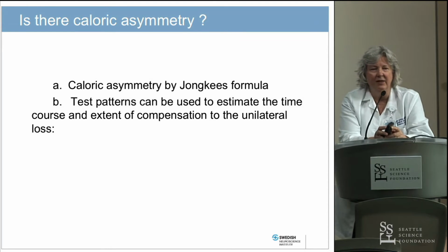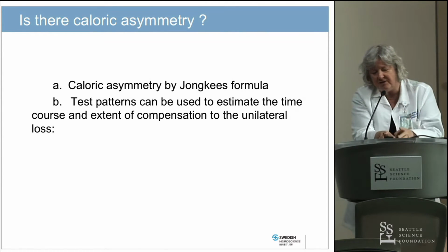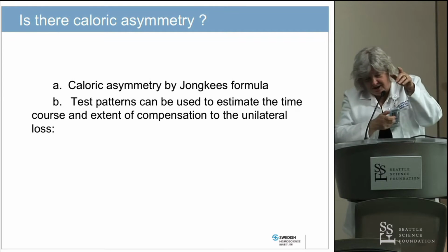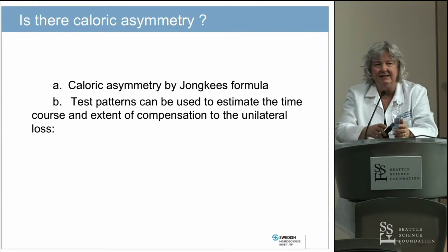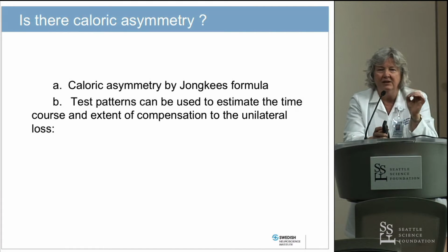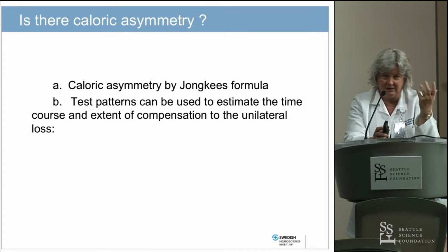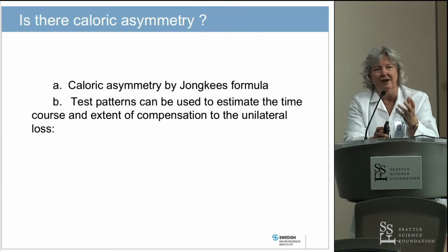It depends on the water being the right temperature, the ear canals being fairly straight, the technician shooting from the same angle to each ear, which can vary, and it's very affected by the patient's level of cooperation. Patients have to be alert but calm during a caloric. If they're too sleepy, you can put ice water in their ear and you will not get nystagmus. It's a certain brain wave that you need to get nystagmus. If they're too nervous, you're not going to get nystagmus.